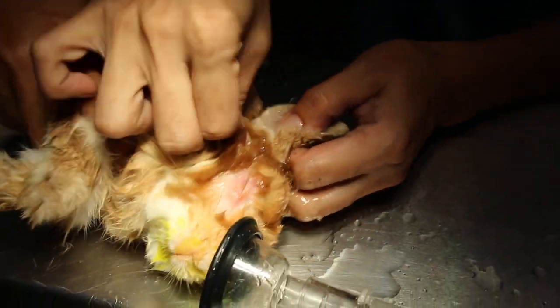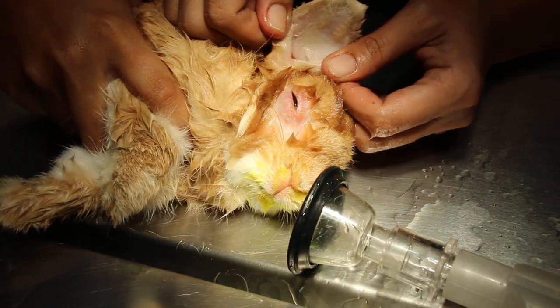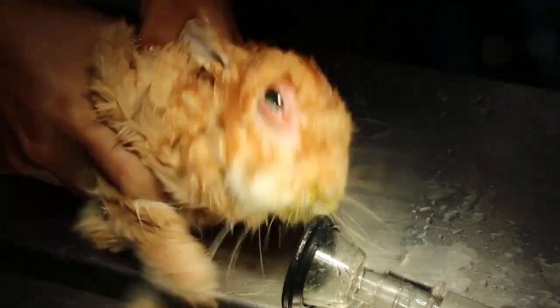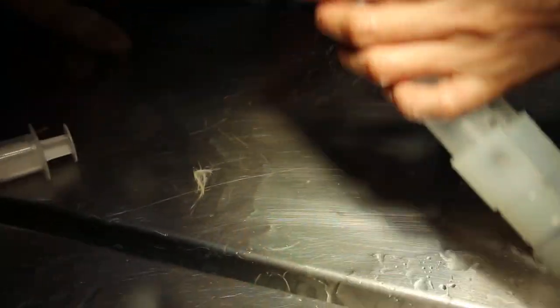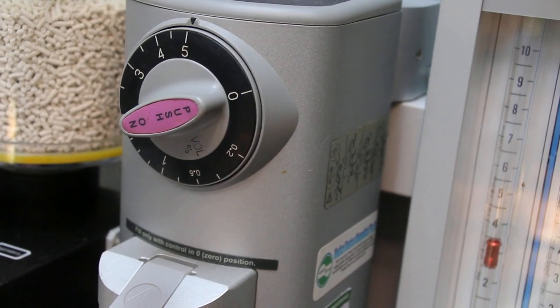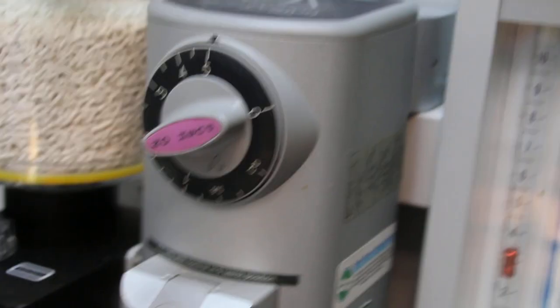Put back the gas again. Nothing came out. Then we just flush the other ear since the rabbit is under. Put back some gas, I put back to 5 again, then count up to ten — one, two, three, four, five, six, seven, eight, nine, ten. Put back to 2 again. And that's all — you flush the ear.